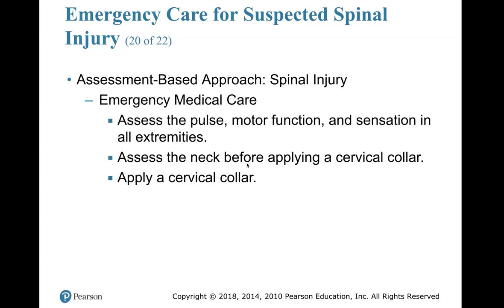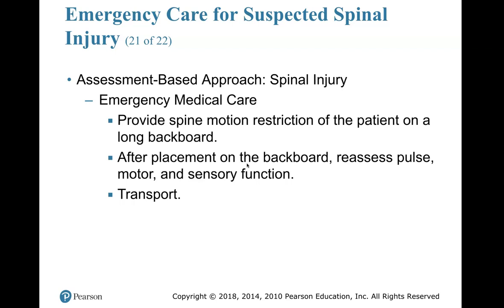Assess the pulse, motor function, and sensation in all extremities. Assess the neck before applying a cervical collar. Please, please, please palpate the cervical spine before you apply a C-collar, and then apply your cervical collar. Provide spine motion restriction of the patient on a long backboard. After placement on the backboard, reassess pulse, motor, and sensory function and transport.